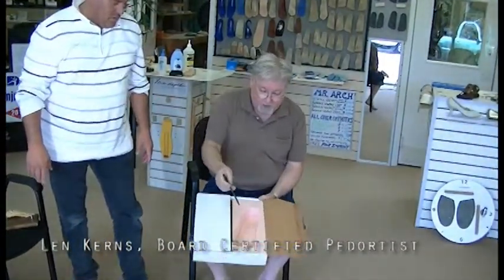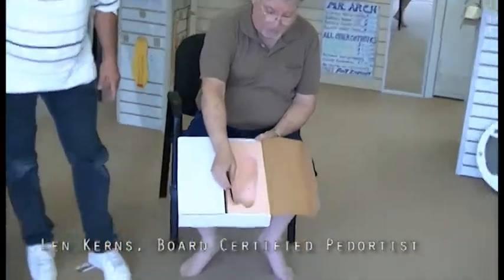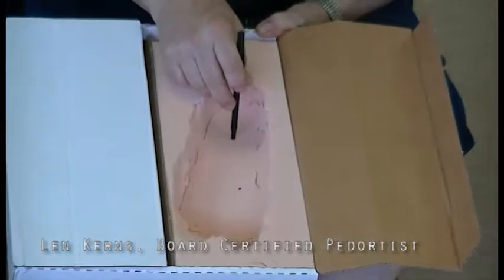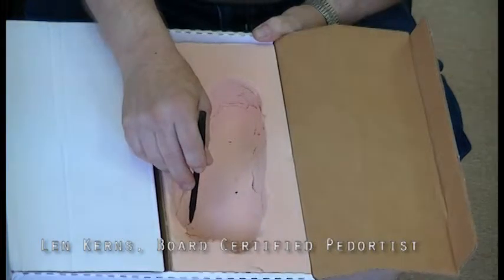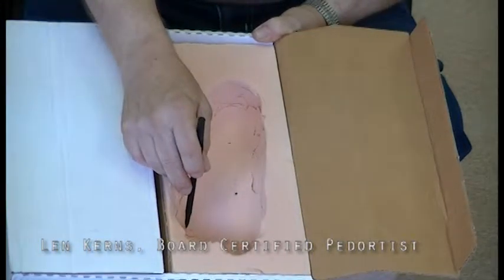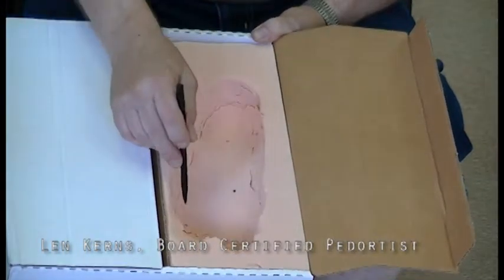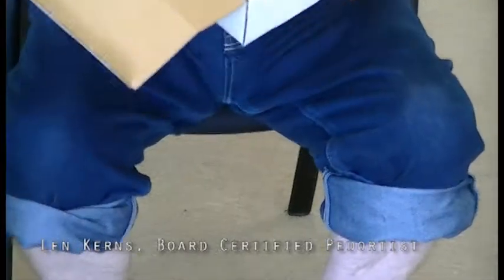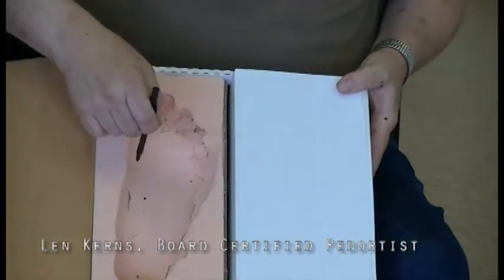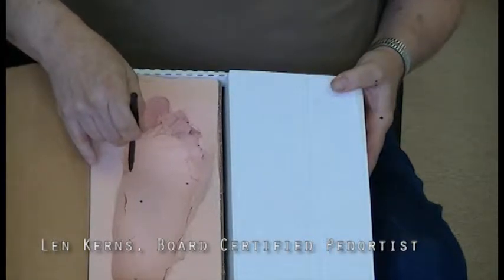He's basically bringing them down all level, but just so we can emphasize, as you can see, this is the same depth. Here's another trick. If you make a little circle with your pen, and you come to the middle of the fifth, you have to find the middle of the fifth metatarsal head, the lowest point here. Those two holes would be the same. And over here, where my first metatarsal is, remember I have 9 degrees of forefoot varus, which is exceptionally high. Most patients have an average of 4.